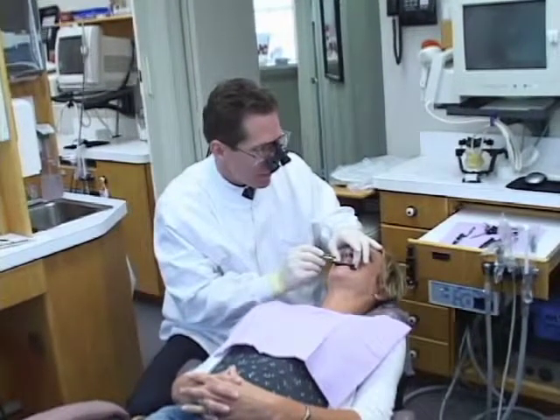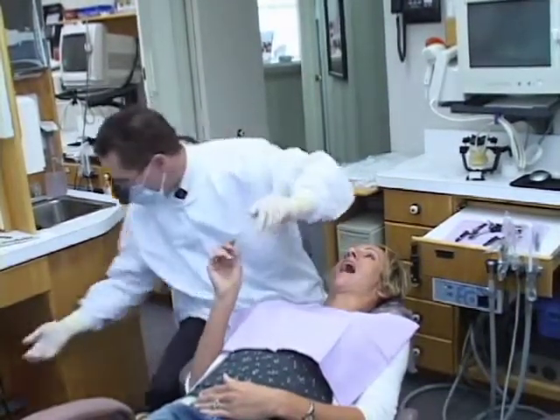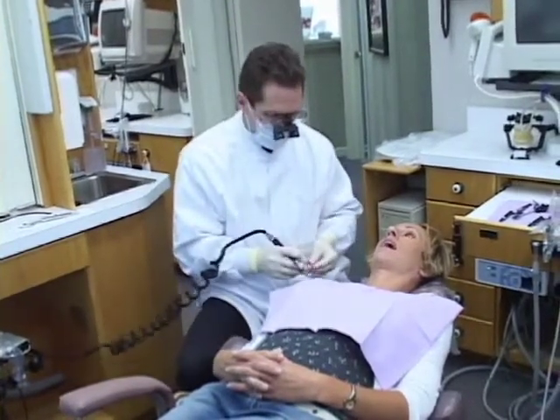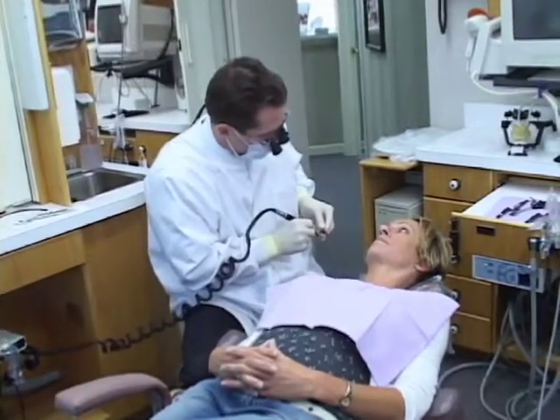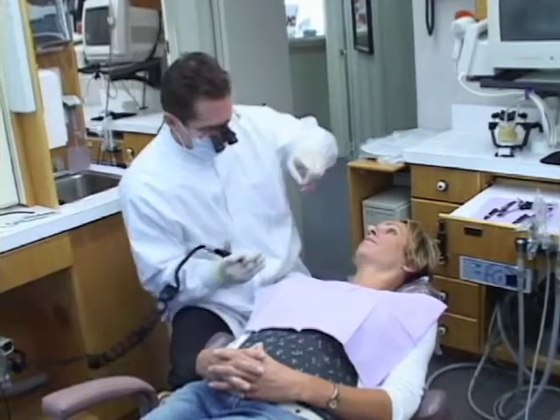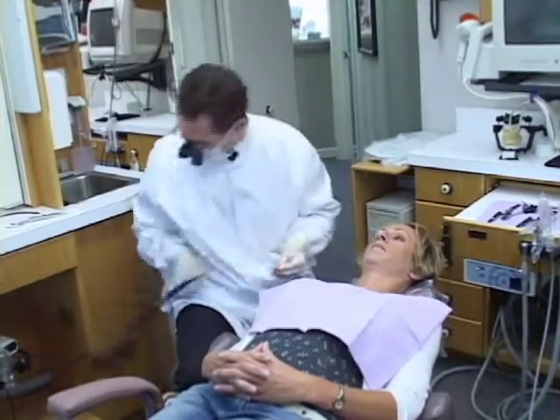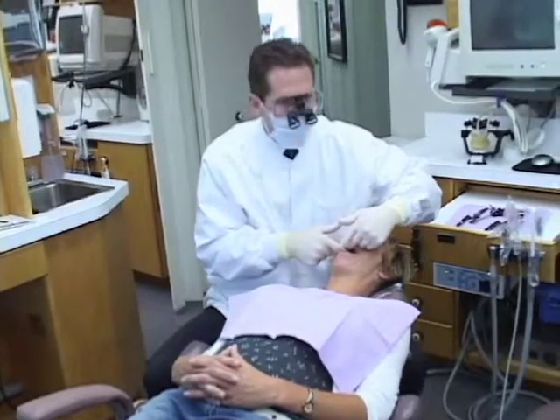Go ahead and just tap your teeth now. Go ahead and take your splint out for me, if you would, please. When we adjust this, a disc works really very nicely — it allows us to keep a nice flat surface. As I look at that island or that stop, I don't want it to be tilted in any way — right or left, any kind of a cant or any kind of an anterior-posterior. We really want the angle to be perpendicular to the lower incisors coming up and making contact, so there's no anterior or distalizing force on that. I'll just adjust a little bit here.